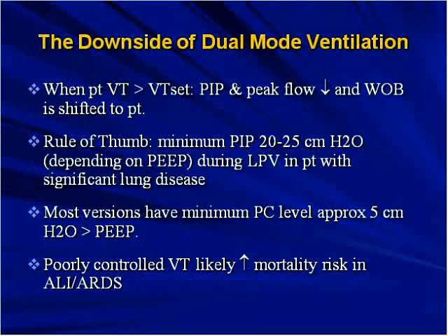So they're like 10 over 5. And many of these patients were in overt shock, a couple of them in cardiogenic shock, and they're basically getting no support from the ventilator. And the fact that there's an active expiratory valve, they couldn't pop off, there was no signal to the clinician warning them of this. So you need to be very, very careful with it. And also, poorly controlled tidal volume likely increases the mortality risk in ALI ARDS.